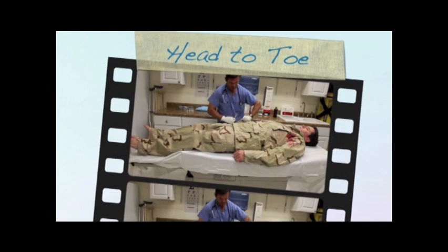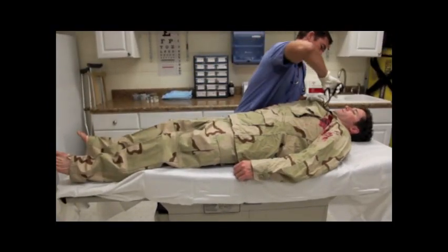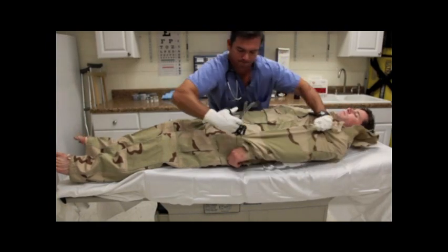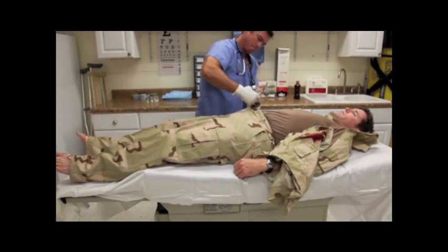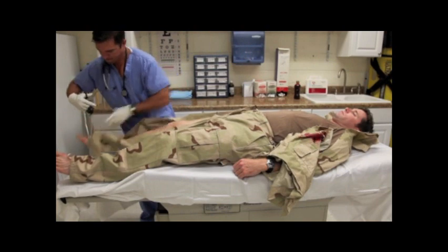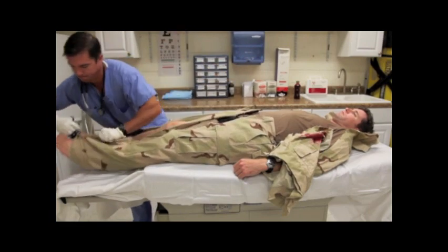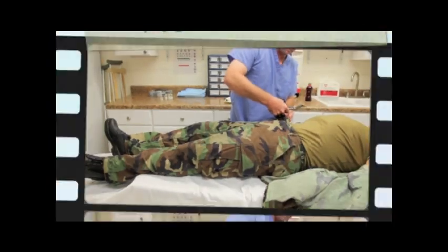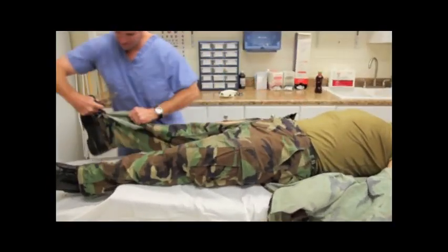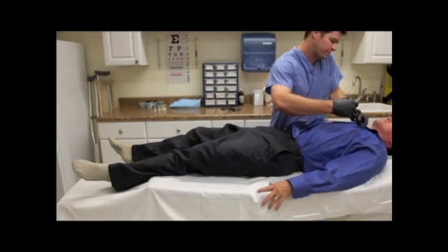Now let's see some other examples. Here we have a set of Desert Cammies. You can see our medic start difficult cuts with a snip and then he rips. See how easily he cuts through the material. If he ever gets to a snagging point, he simply will switch to the trauma shear portion of the unit, easily transitioning between the two tools.